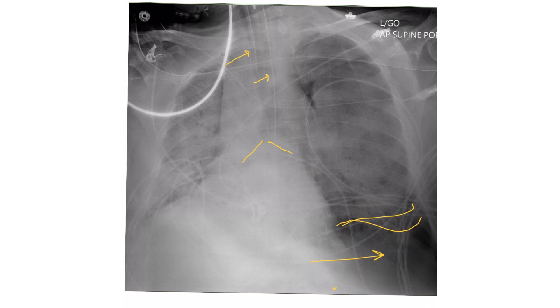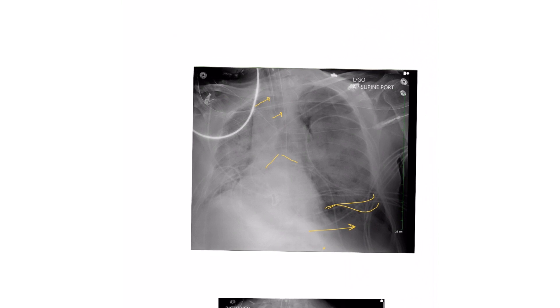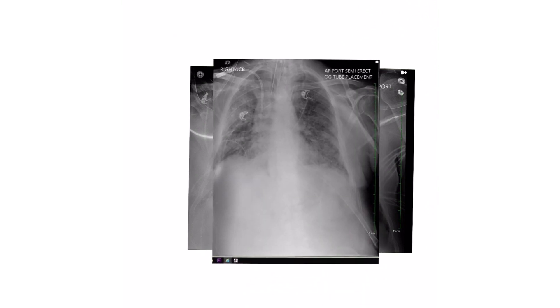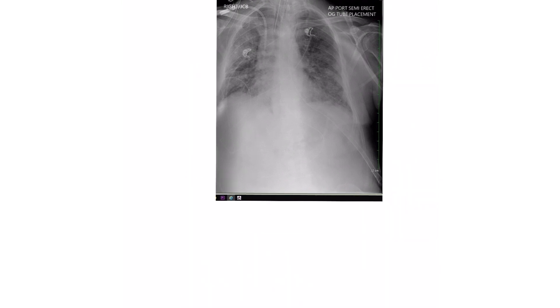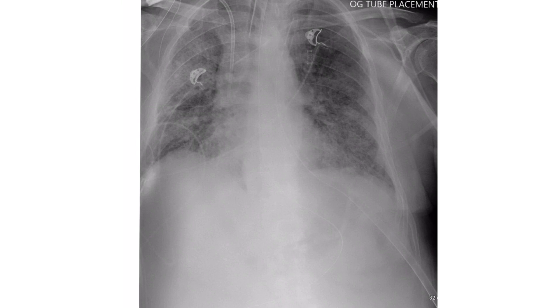You can see bilateral diffuse infiltrates in the lungs. We placed a chest tube — zooming in here, you can see the chest tube coming from outside and sitting in the left upper lobe, with the tip right here. The pneumothorax has resolved and the lung has expanded because the chest tube evacuated the air out, restoring normal pulmonary physiology, negative intrapleural pressure, and allowing the lung to expand to its normal position.